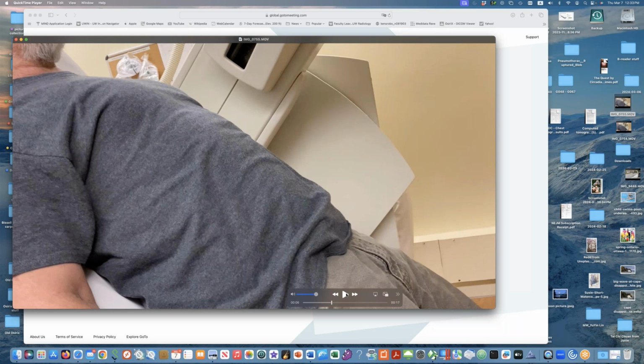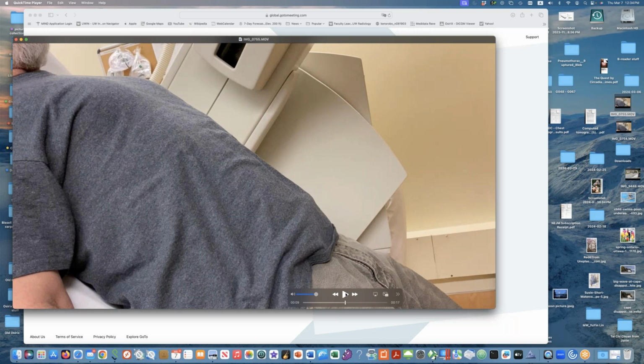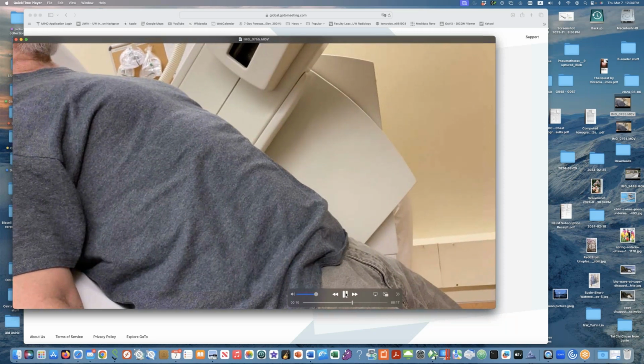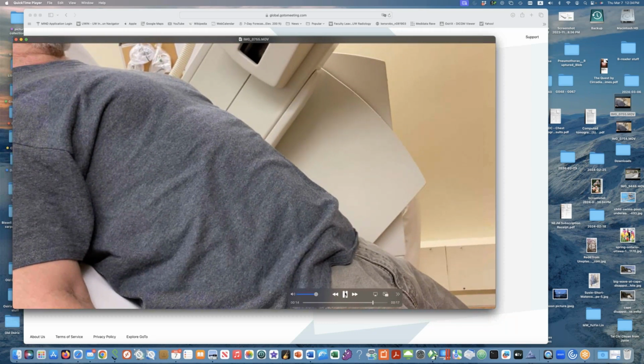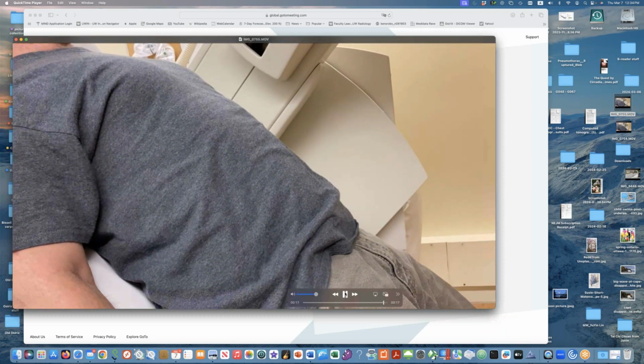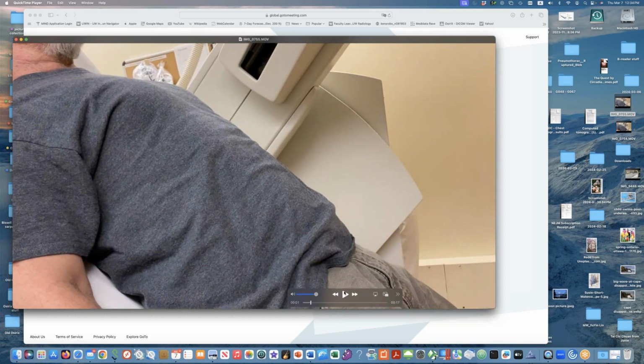But you'll see that his abdominal muscles here are actually moving paradoxically. They're going up, and the abdomen is going in as his chest wall goes up. Yep. Blow it out. So this is called paradoxical breathing, and this is a sign of bilateral diaphragm paralysis. Breathe normally. Yep, thoracoabdominal paradox.